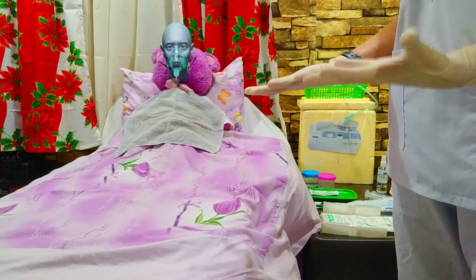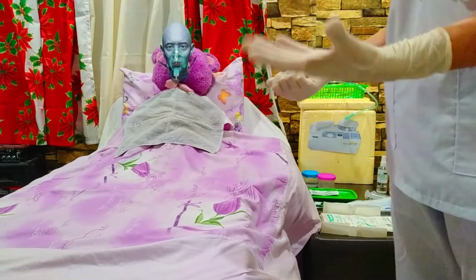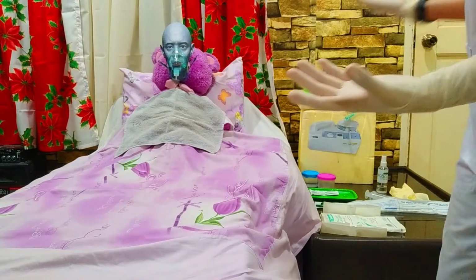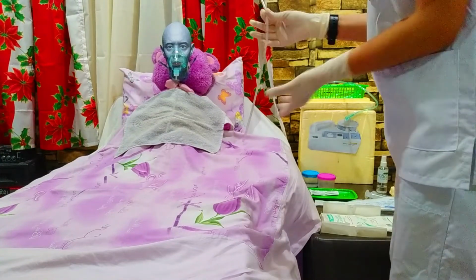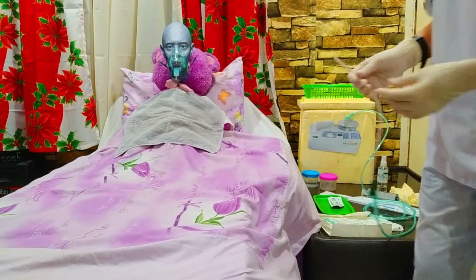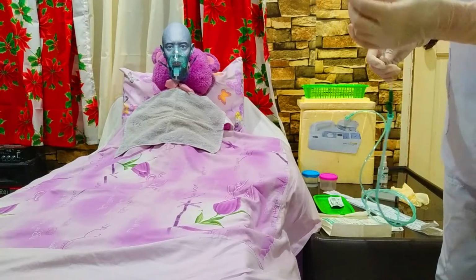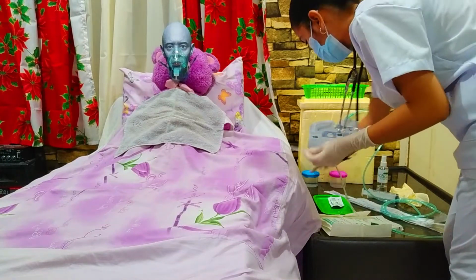After donning sterile gloves, the dominant hand will manipulate the catheter and must remain sterile, and the non-dominant hand is considered clean rather than sterile and will control the suction valve on the catheter. And we need to moisten the catheter by dipping it into the container of sterile saline. Occlude the suction valve on the catheter to check for suction.